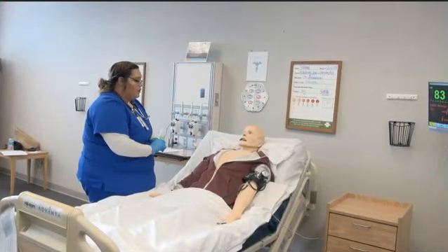Notice she explained the procedure and what she will be doing with the patient. She also did a brief interview by asking the patient if they use any medication or a home nebulizer at home. She even asked if they use oxygen at home. Next, the respiratory therapist will perform their assessment. This will be done by checking a pulse and comparing it to the monitor. She will assess breath sounds and respiratory rate. This will provide the respiratory therapist with a baseline to compare during the treatment and after the treatment.